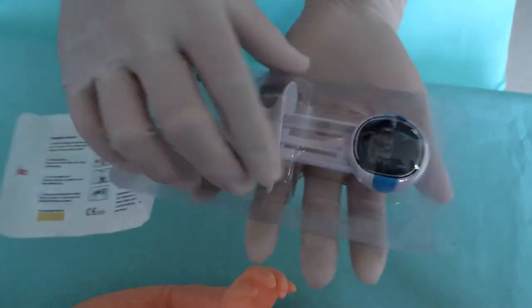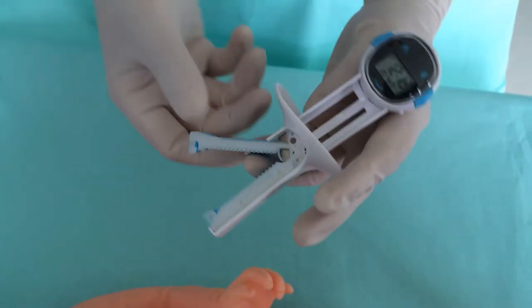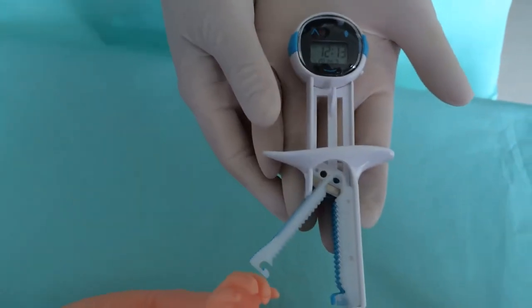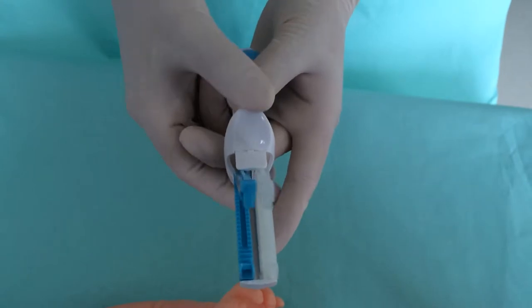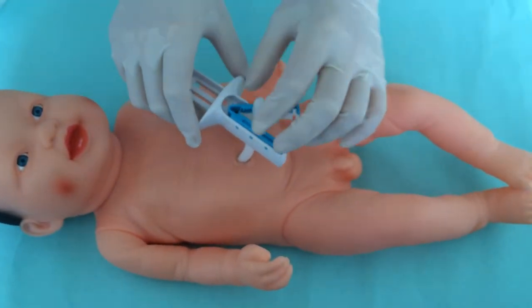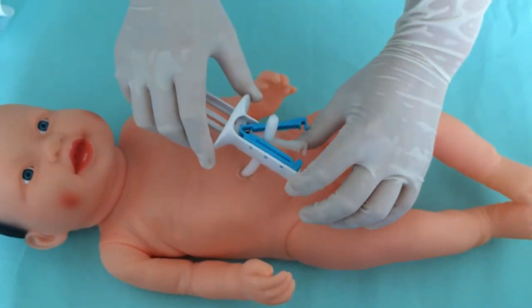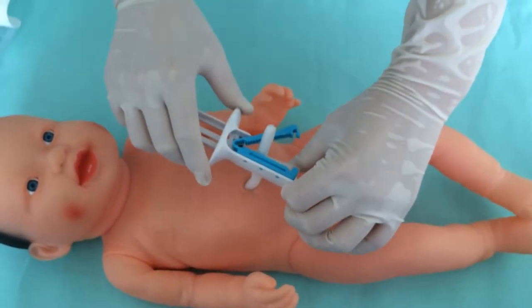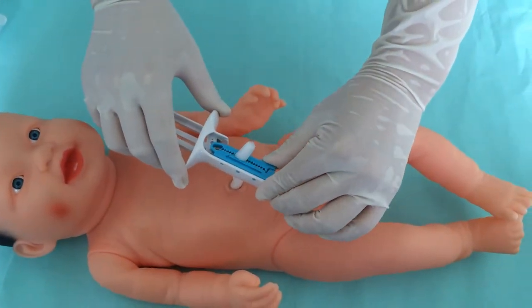Take out the electronic recorder. You can see two clamps: a white one and a blue one. Face the white one to the baby. Put the umbilical cord deep into the v-groove, about 3 to 5 cm from the baby. Close the white one first, then close the blue one.